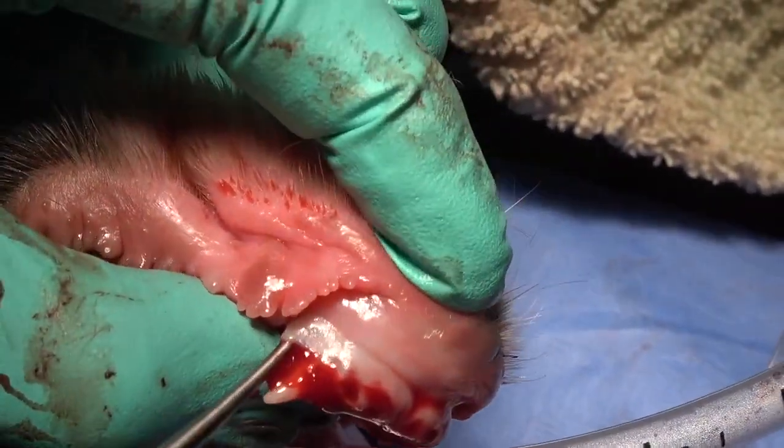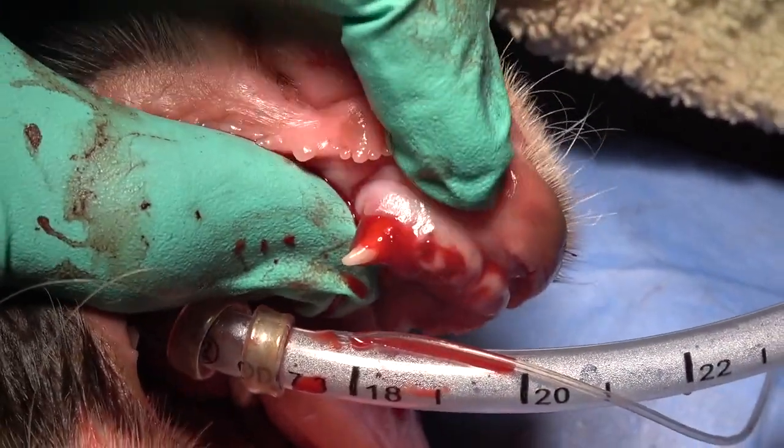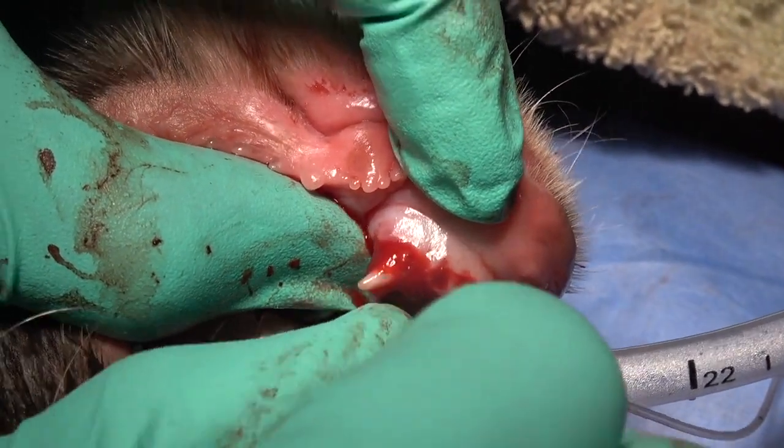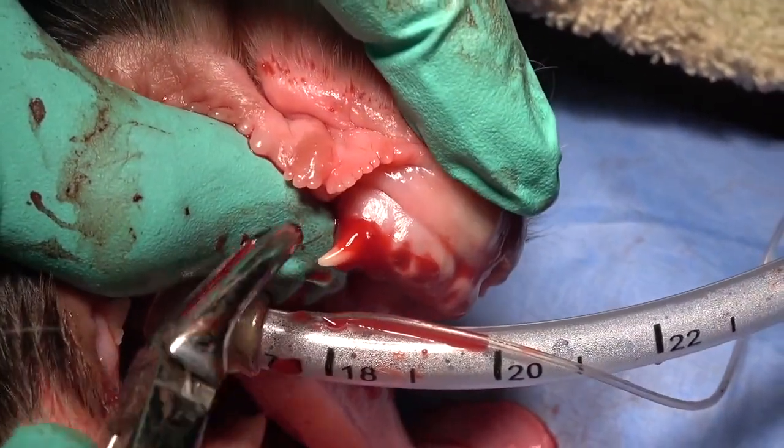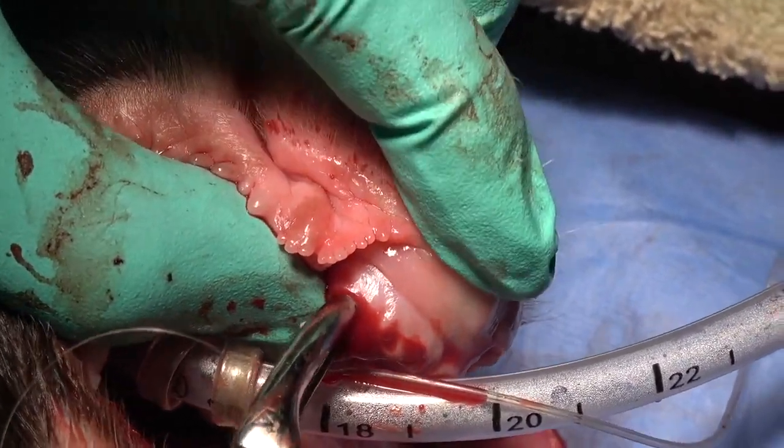Once that's done, you should have significant mobility. If not, just repeat the process. But if the tooth is that mobile, you should be ready for your extraction forceps — mainly pull with a little torque — and you should be able to complete the extraction.